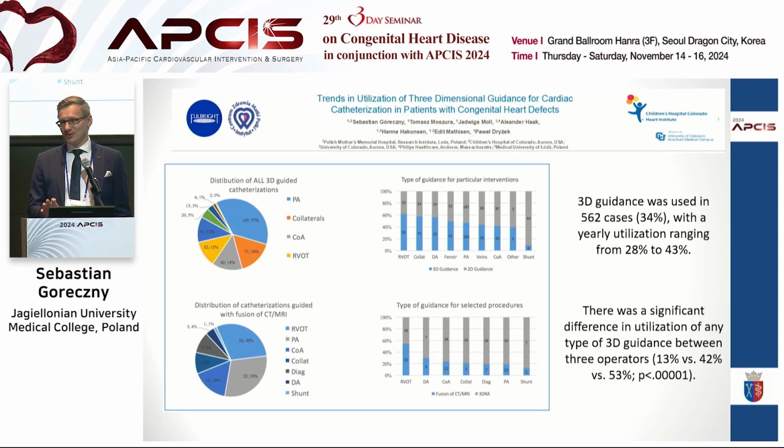So it was dependent on whether the person in charge actually bought into the idea of using 3D imaging. And there was one person that used it only in 13% of cases, whereas another operator used it in every second case. So I guess this is also important, your attitude towards it.